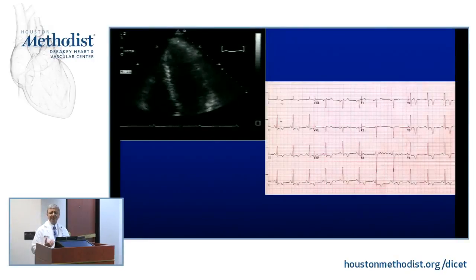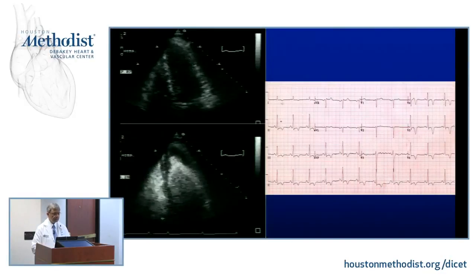I really would pity people who are not using contrast, and I say that because it is a medication, a drug that can convert something that you have to guess very hard for. And we're preaching to the choir here because I think we use it very appropriately. But you need to know that there are many laboratories who don't use it. And the utilization currently in the States is probably about 3%, has increased maybe less than 1% or so. So quite a low utilization. So what do you think about this case?